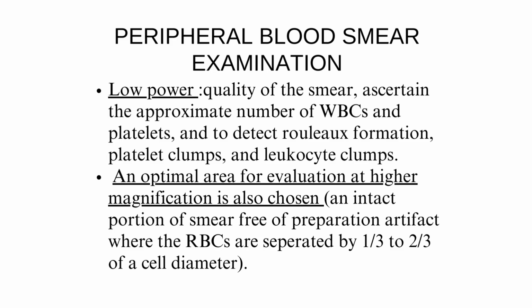Under a typical microscope that we use, we have 10x, 40x and 100x. So 10x is considered your low power, high power is considered your 40x, and then we have the oil immersion. At 10x or low power, you're seeing the quality of the smear, if it's an adequate smear, and we also want to see the approximate number of WBC and platelets.